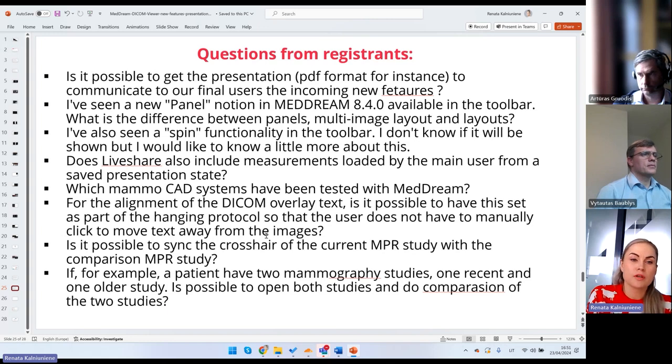Is it possible to get the presentation in PDF format, for instance, to communicate to our final users the incoming new features? As I mentioned in the beginning of our webinar, you will receive the link to the video recording and this presentation in PDF format. So you can download it and show it to your end users, of course.